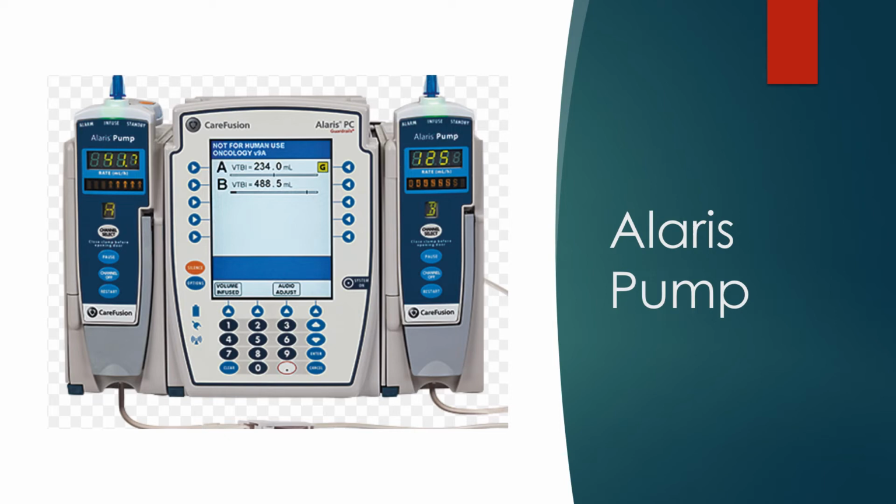The other thing I want you to be familiar with is if it is running on the pump, we're calculating that per hour. If we're running our fluids by gravity, we're going to count each drip per minute and then set that rate per minute to know how much fluid we are administering. So the pump is per hour, the drip is per minute.